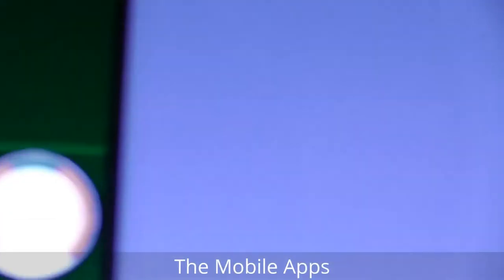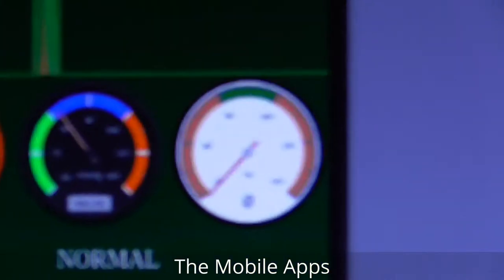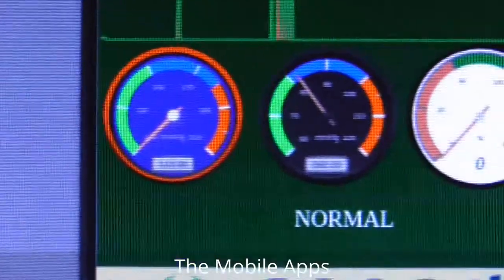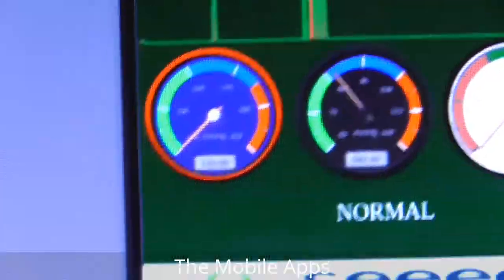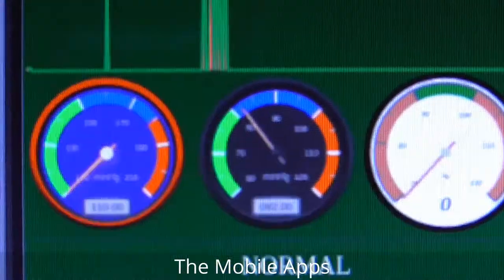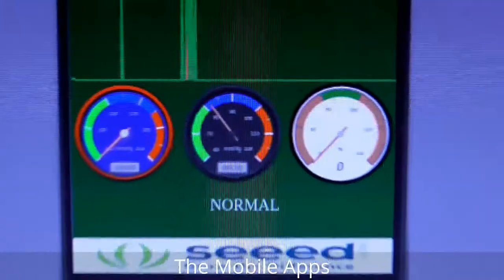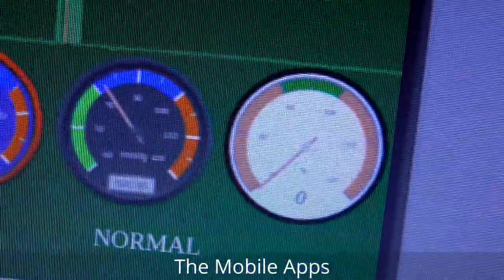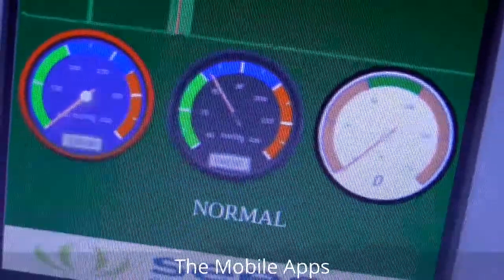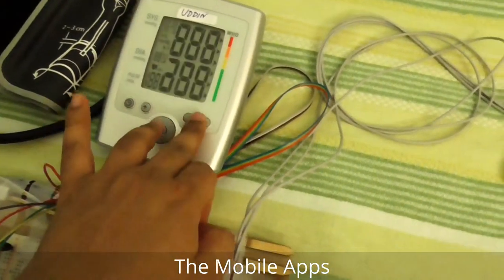The pulse oximeter shows the pulse and the SpO2 sensor. These two values are the blood pressure — the blood pressure machine is a little tricky. It shows the previous last value, which is 110 over 85. So it shows the last recorded value — 110 over 82.